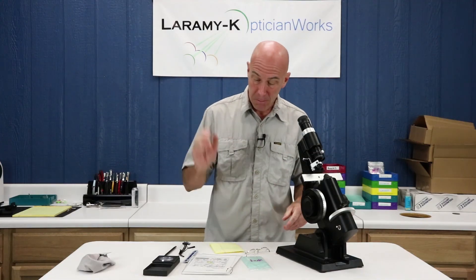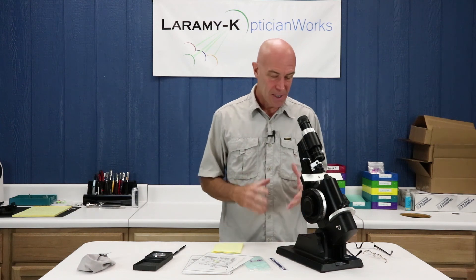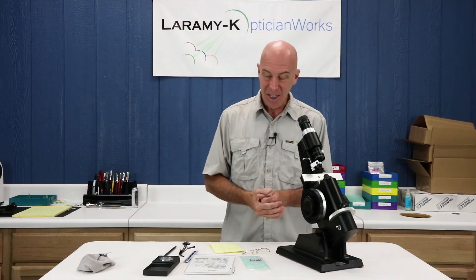Bifocals — lined bifocals — are just becoming kind of dinosaurs. You may or may not even see them anymore in your lifetime, but you do need to know this stuff. When they do come along, just practice, practice, practice. It's not going to be perfect or beautiful or crisp; get used to the steps involved, and when you get to any practical exam you're going to be fine. That is lens kit number four, a lined bifocal. Next week we hit progressives — I will see you then.